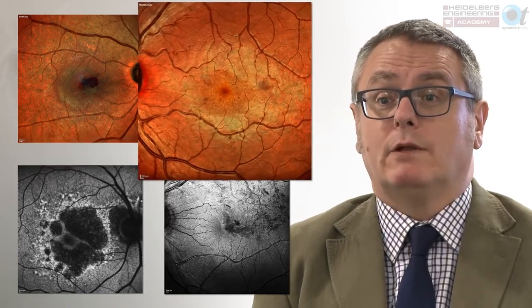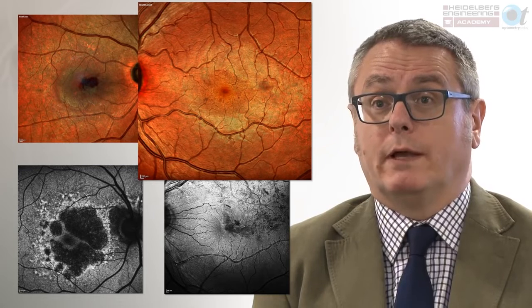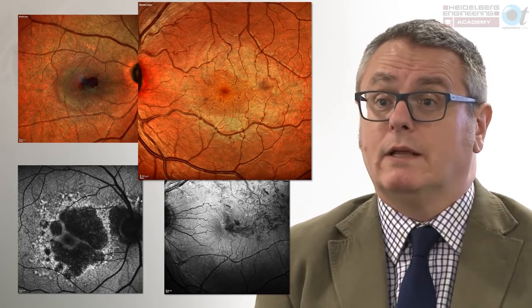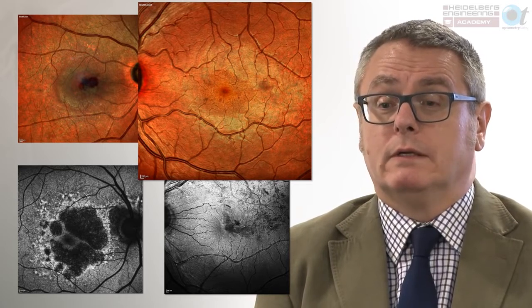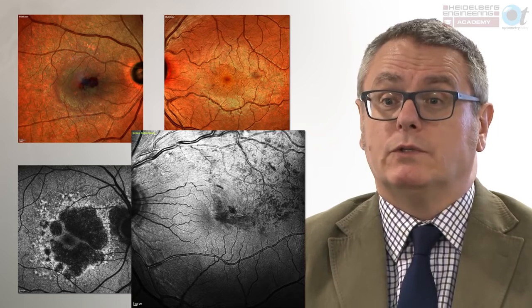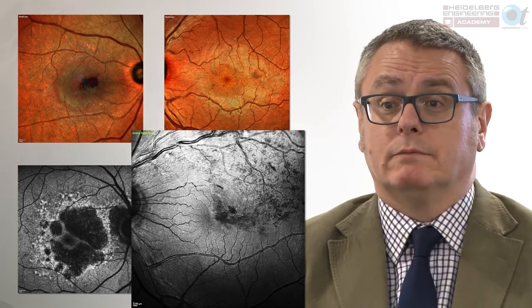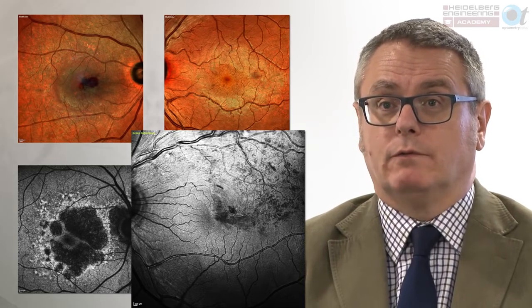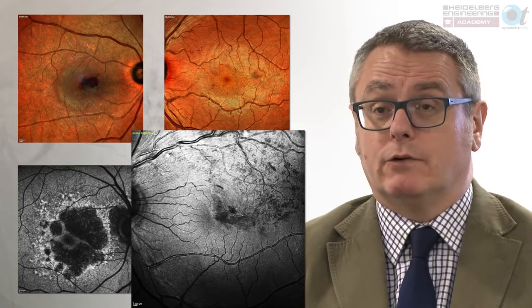If there's evidence of breakdown in the blood-retinal barrier — exudate or multiple microaneurysms — you're likely to see structural change, and your OCT needs to cover those areas. If you see areas of hemorrhaging or subretinal fluid, significant structural change is likely, and that's where your OCT scan should be centred. The final example is a patient with a branch retinal vein occlusion extending into the supratemporal quadrant of the retina, so your scans may need to extend outside the standard 30-degree field of view.